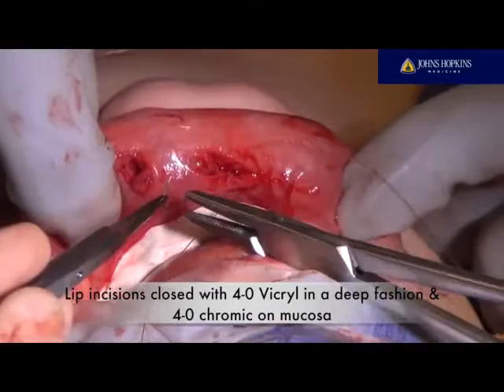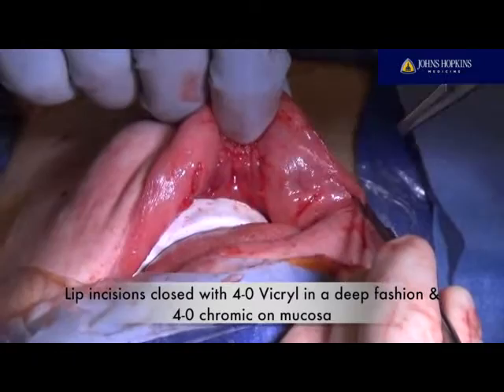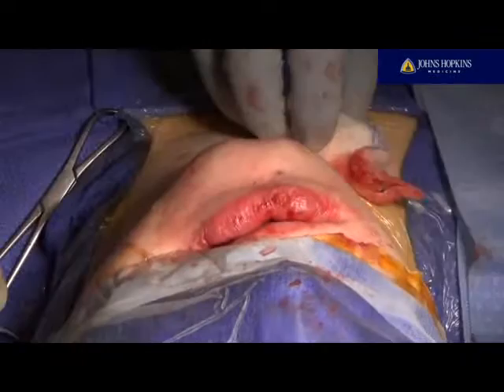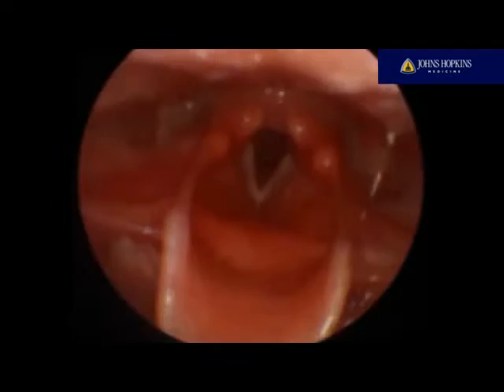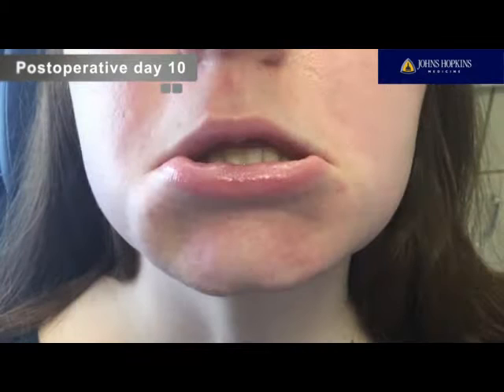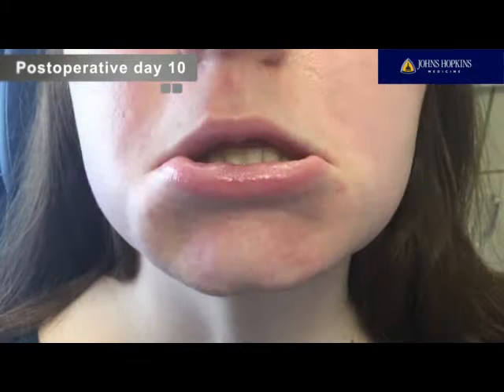Finally, the lip incisions are closed with absorbable gut suture and the tooth guard is removed. This is the final appearance of the lip incisions. A jaw bra is placed to gently compress the neck. No drains are placed. Postoperative laryngoscopy demonstrates full mobility of both vocal folds. This is the postoperative appearance of the patient 10 days after surgery, demonstrating full lower lip movement, intact sensation of both mental nerves, and an excellent overall cosmetic appearance. Thank you very much.